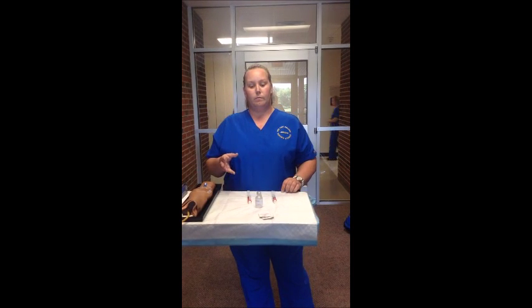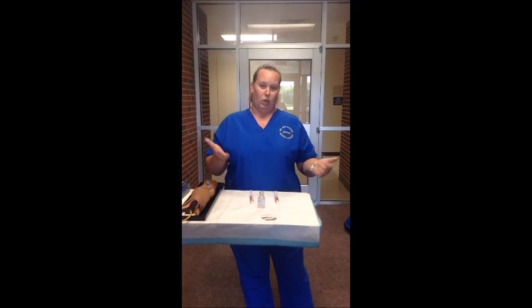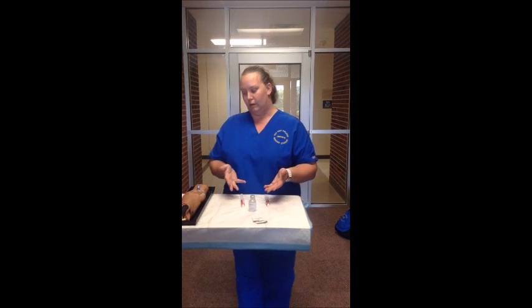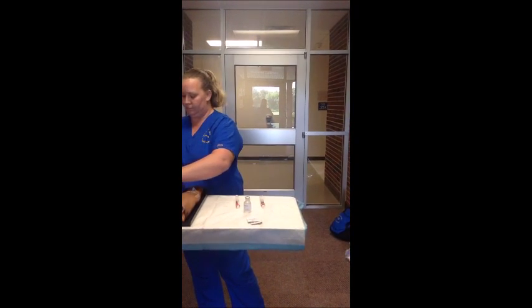And I would, at that point, go ahead and document or verify that I've got the right patient, the right drug, the right dose, the right time, the right route, and documentation. And then I would go to the med room and start getting my medication set up. So I'm going to perform hand hygiene.